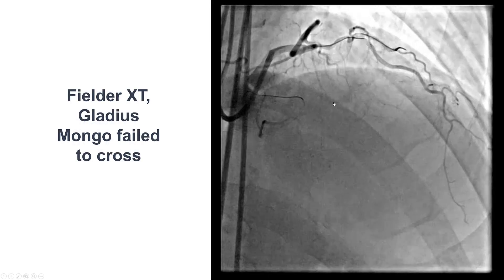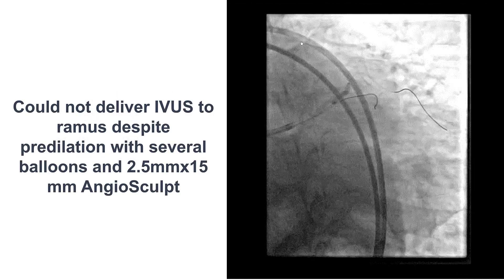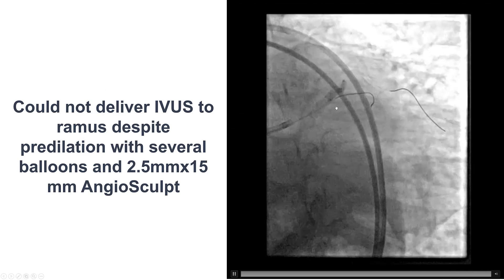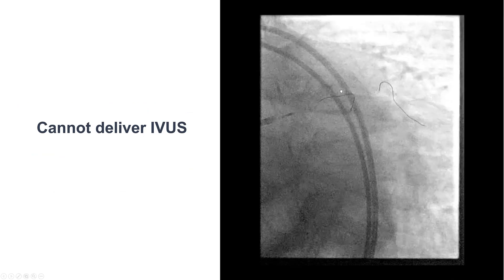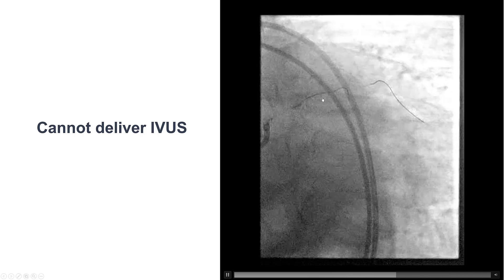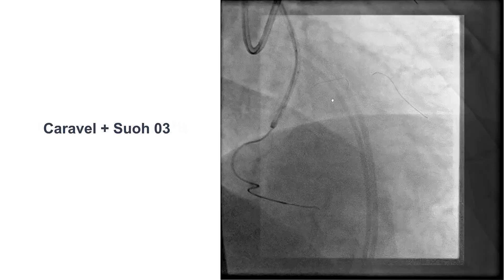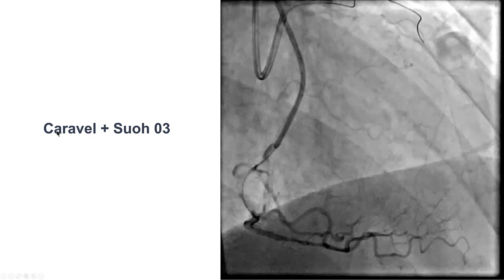We did multiple attempts to cross into the LAD using various guidewires without success. We used a dual-lumen microcatheter also without success, and then we tried to deliver the intravascular ultrasound catheter to the Ramus to clarify the proximal cap for the LAD, but we were unable to deliver it despite predilatation including with an AngioSculpt balloon. The IVUS catheter just could not advance over the Ramus or into the diagonal. So after multiple attempts we decided to switch to the retrograde approach.